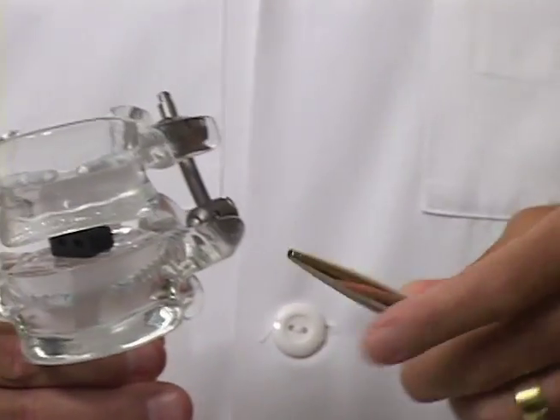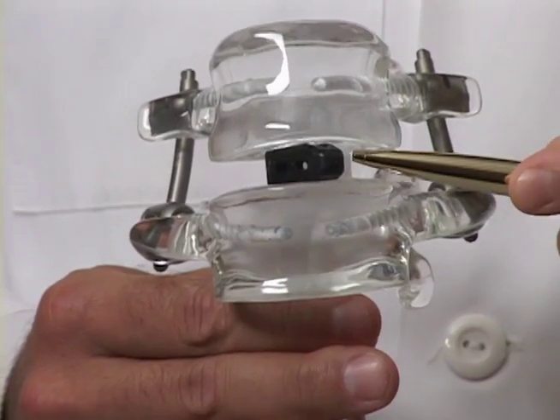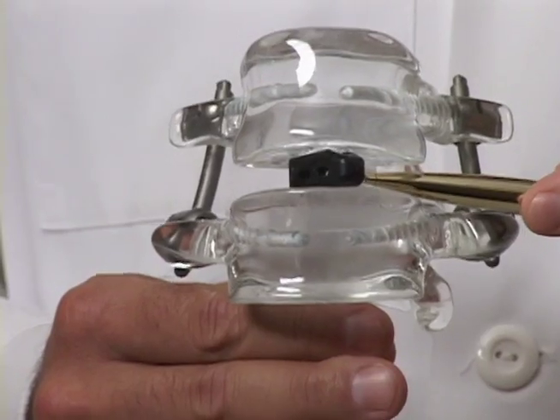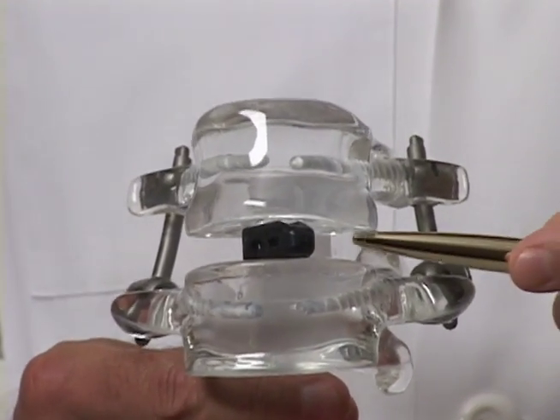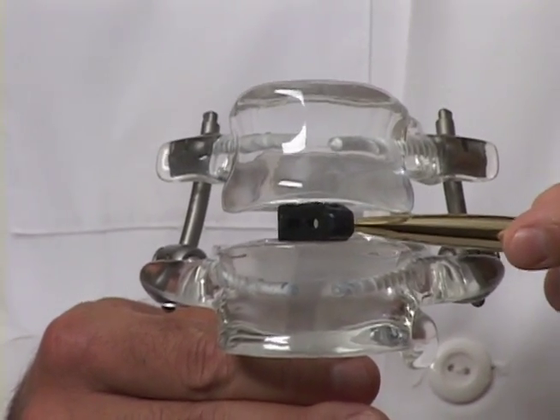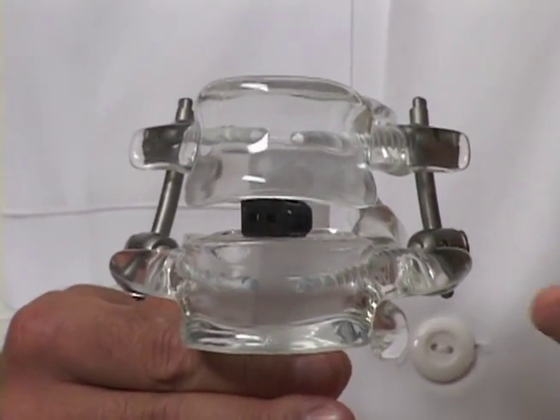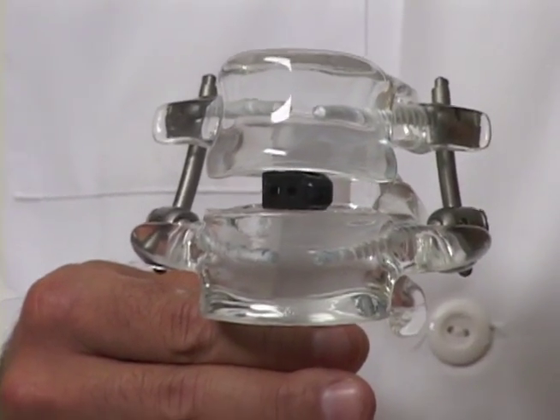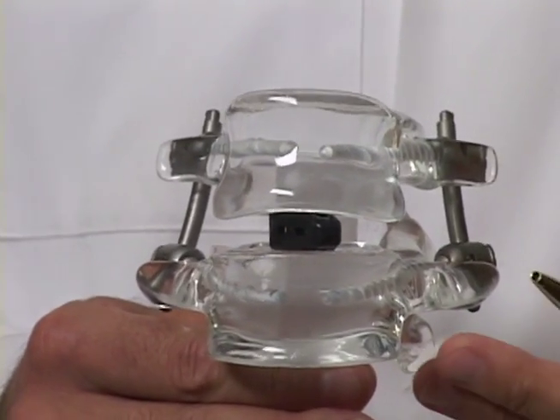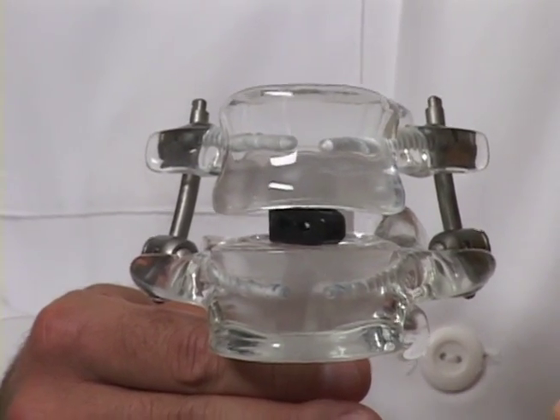Once I get down into the disk space, I remove the disk material and insert a small cage — what we see right here. This is a carbon fiber cage, though different kinds of cages can be placed into the interspace. This device is a hollow prosthesis that allows for insertion of graft material. We can use cadaver bone, the patient's own bone, bone morphogenic protein, or a variety of other available graft materials.